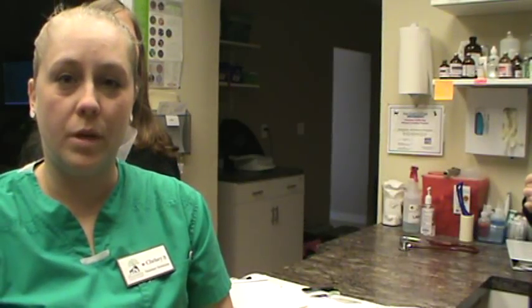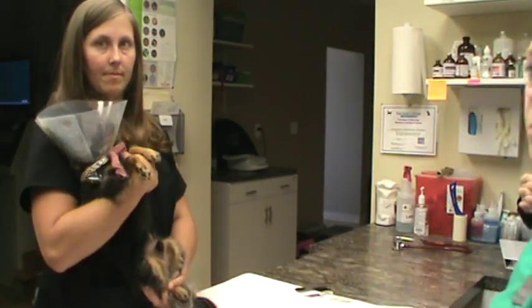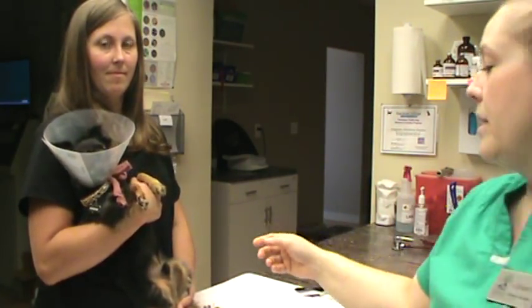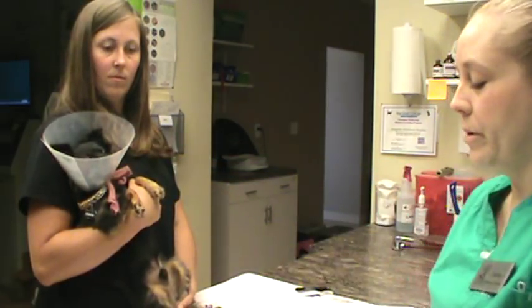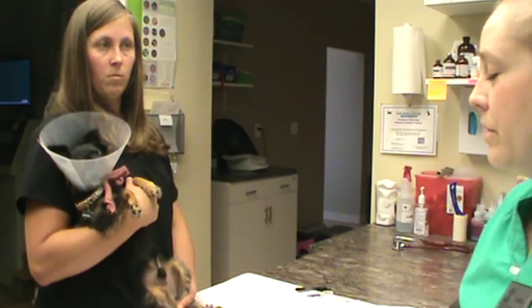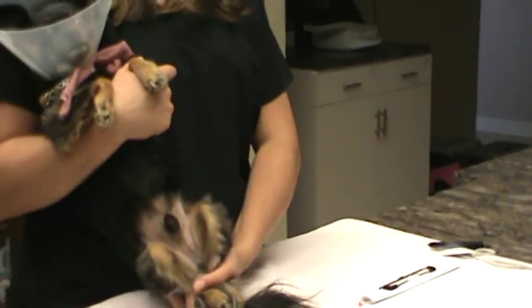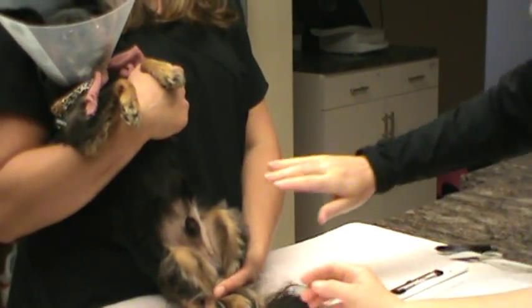This is Chelsea Marks for VETT 221 Test 20, covering suture removal and a canine neuter. We have our patient Zephyr here, restrained by Assistant Bree. He's been wearing his e-collar and we're about 14 days after his post-neuter. He has a staple, so we're going to show you that staple removal, and Dr. Magruder is going to take a look at it as well.